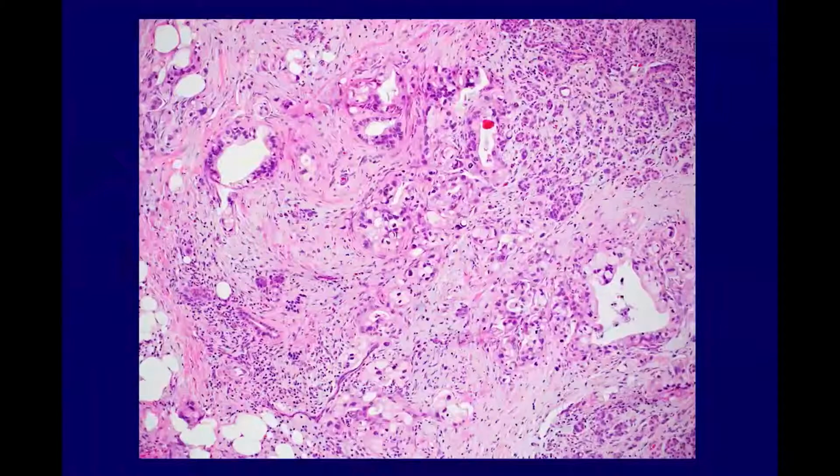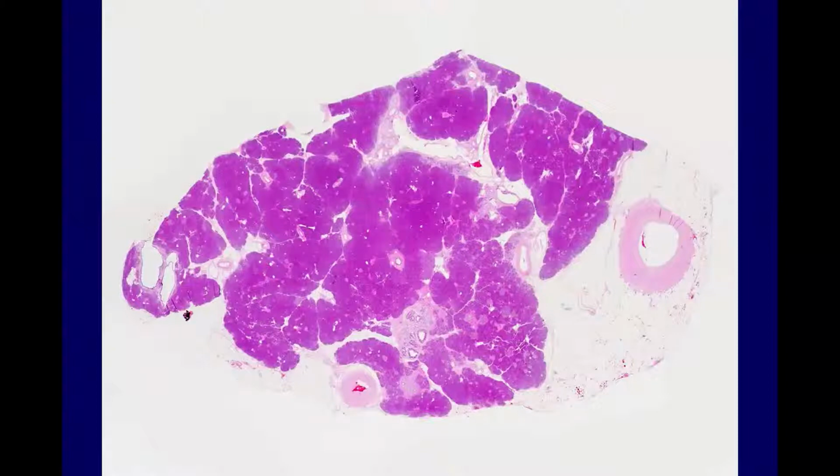So again, this example was pretty straightforward. We can see quite clearly that we have an infiltrative growth pattern, that we have great nuclear size variation within individual glands. We have, again, that haphazard growth pattern. In some cases, though, it's just not as clear as our original example. So here's a section that actually came from the pancreatic neck resection margin from a Whipple specimen. And we can see that while lots of the pancreas looks really happy, normal lobules with ducts in the center, you do have this little area of proliferation of glands here that's not quite clear what's going on with them.